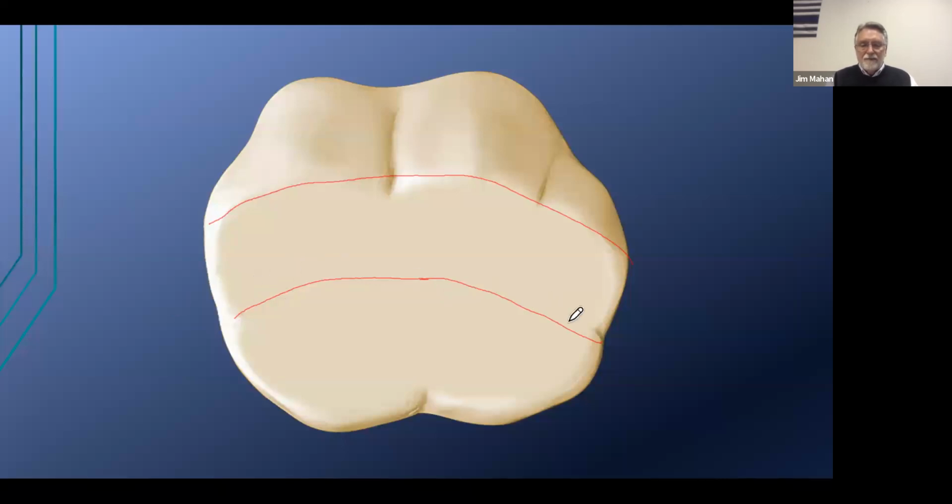What is this guideline for? It's to help us properly position where the pits are. The pits are the driving force of the occlusal anatomy, so we first have to establish them. We go to the beginning of the cusp ridge, 45 degrees in, make a pit. Notice this marginal ridge is considerably smaller than this one in length. It doesn't concern me because my stable references go from the beginning of the marginal ridge, go in 45 degrees and make a pit.